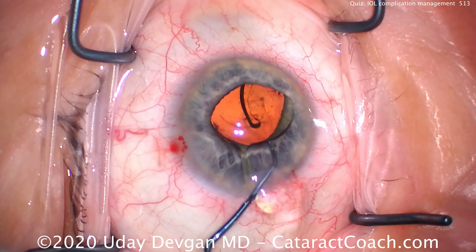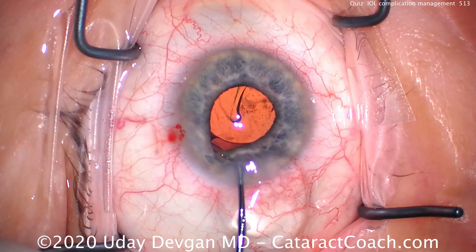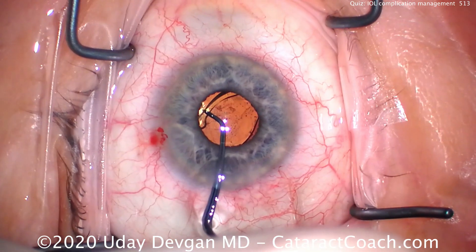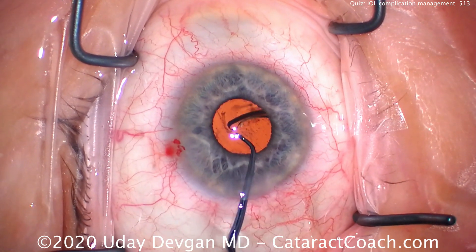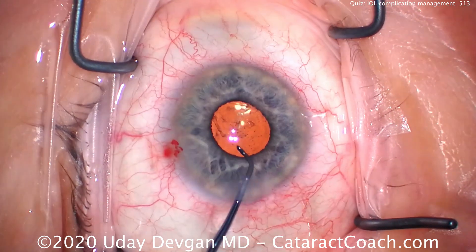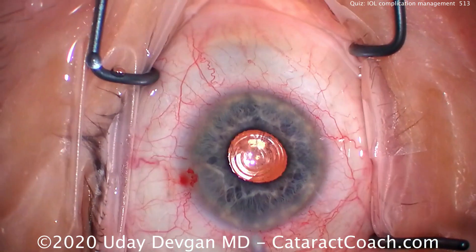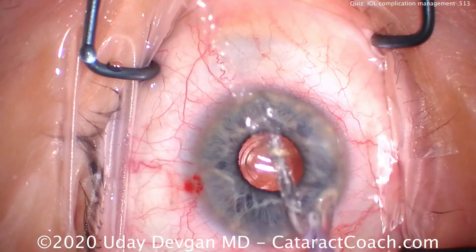We'll use our chopper to dial in this lens, making sure that the entire lens — both haptics and the optic — are going to sit securely within the capsular bag. There it goes, nicely positioned. We'll rotate it a little, get the other haptic to open up, and then it's time to remove the viscoelastic with the I/A probe. This patient does have a slightly smaller pupil and you can see the reflections of the rings — this is a trifocal IOL. Here comes the I/A probe, placing it inside the eye to remove the viscoelastic.